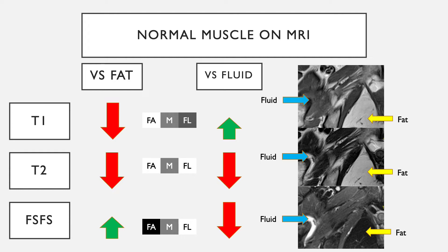On fluid-sensitive fat suppressed sequences, fat is dark, fluid is bright, and the muscle sits somewhere in between. Between the T1 and the fluid-sensitive fat suppressed images, essentially one is a negative of the other — there is inversion of both. Muscle remains relatively gray throughout.